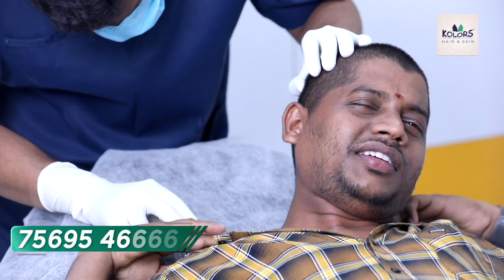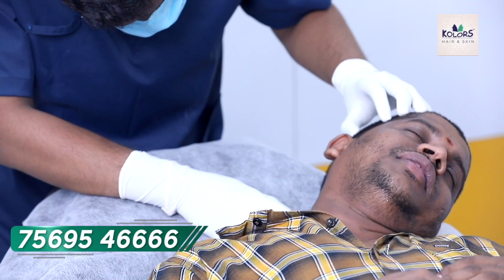It is commonly used for viral indications like removal of warts, molluscum contagiosum, or any benign skin conditions like skin tags, that is acrochordons, dermatosis papulosa nigra, that is DPNs, for removal of seborrheic keratosis, removal of actinic keratosis, and removal of lentigines. Freckles can also be treated.